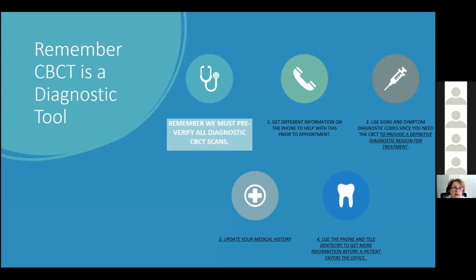So remember that it's a tool. It's really just a tool. It doesn't replace the treatment. It just gives us the ability to show a patient and help a patient understand what's going on between the results of the CBCT scan, what you get from information from your patient, and the signs and symptoms of why you're taking that CBCT scan.